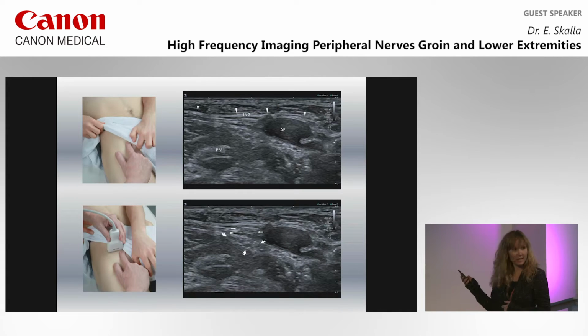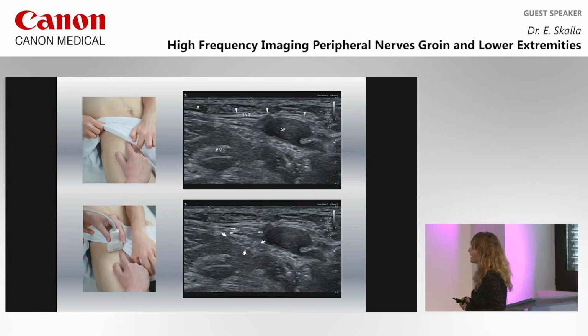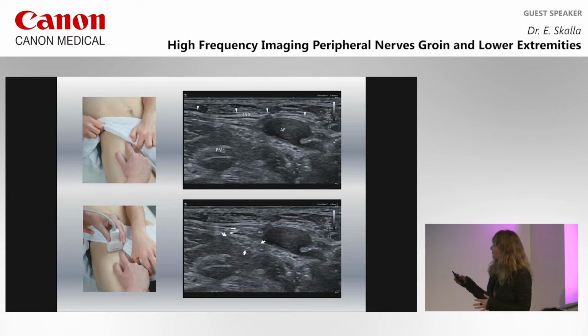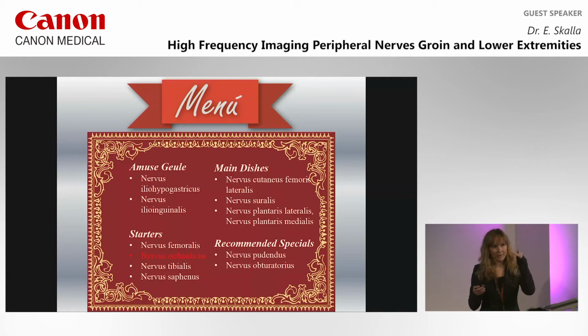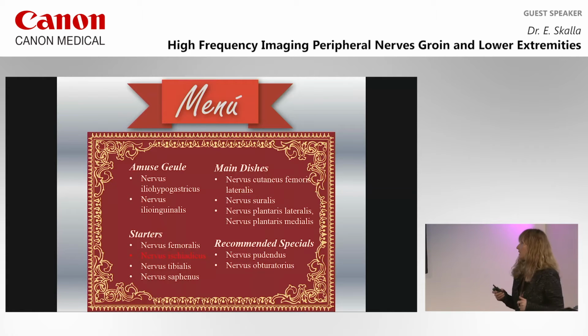And this is a special patient. This nerve is separated by a small artery into a smaller superficial part and a deeper, bigger part. As a variation, it does not have to lie in direct contact with the artery. You could also find it a few centimeters lateral to it. What I have to say, you just have to search directly under the inguinal ligament because the nerve divides very quickly into its end branches and you won't see this main stem for a long distance.